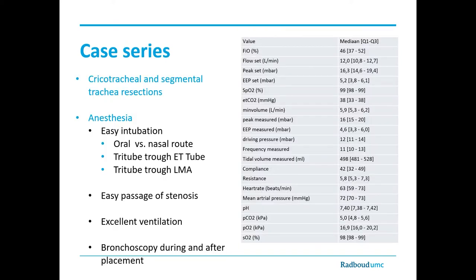This case we just presented to you was actually the start of a small observational study that we performed on the use of Tritube during tracheal surgery. We included all the patients that presented for cricotracheal and segmental tracheal resections, and we recorded data on ventilation and hemodynamics, but also data on tube and ventilation related events.